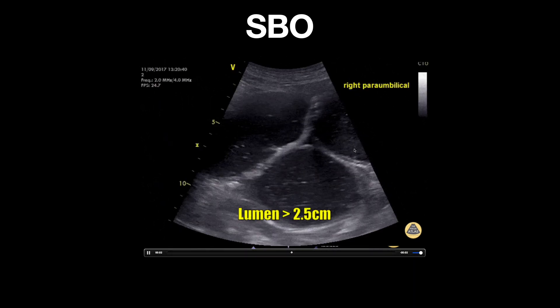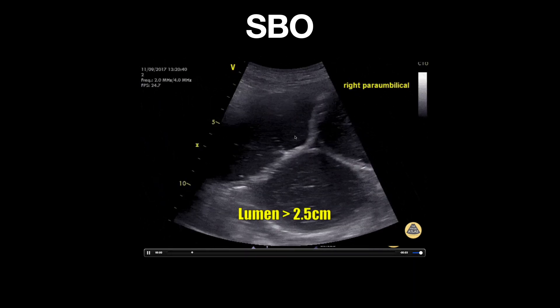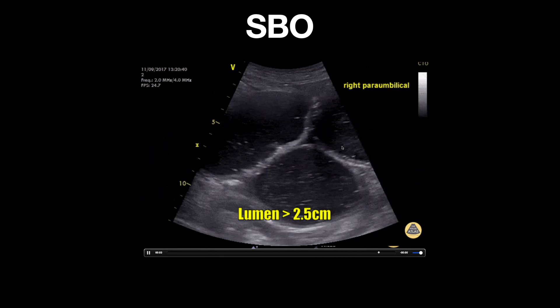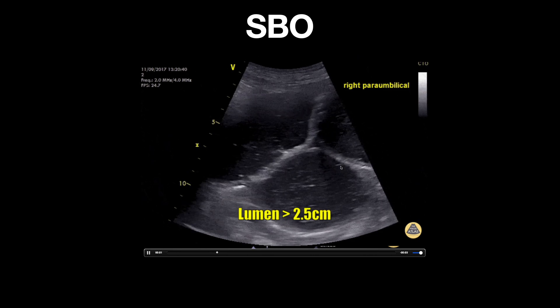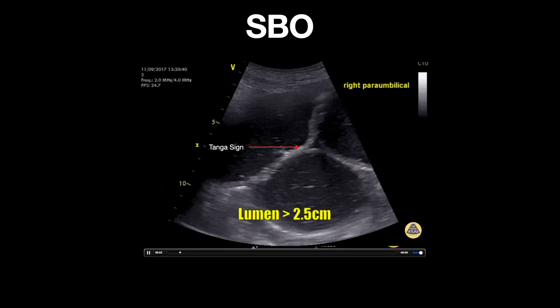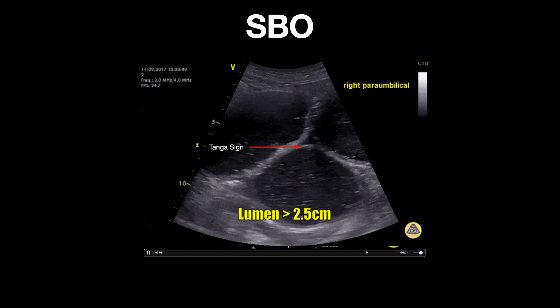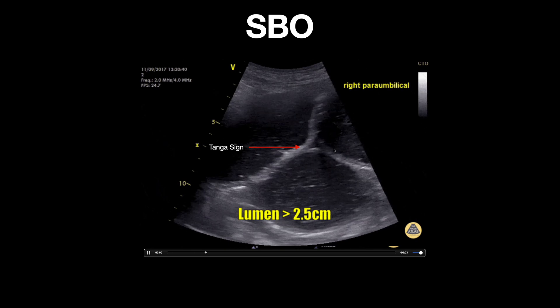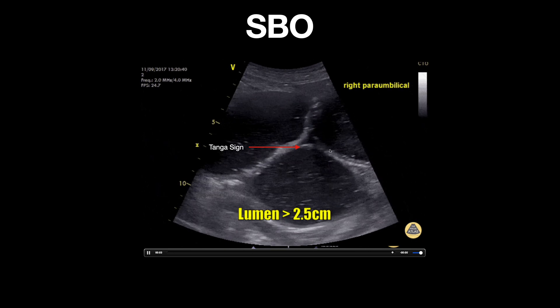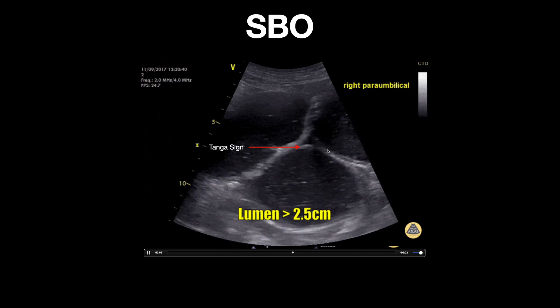Here is an additional clip of a small bowel obstruction demonstrating multiple dilated bowel loops and minimal peristalsis movement. A triangle-shaped anechoic area can be seen here between the small bowel loops — this is known as the tanga sign. This represents fluid between the bowel loops and suggests a high-grade bowel obstruction.